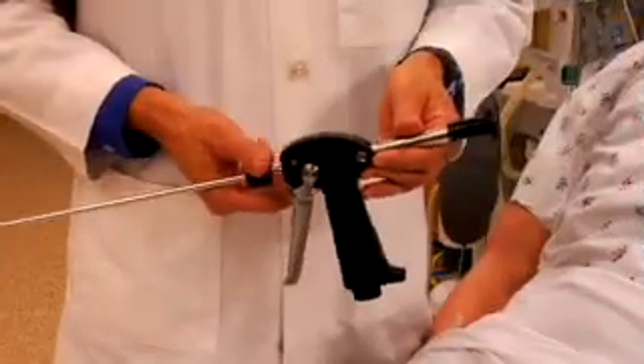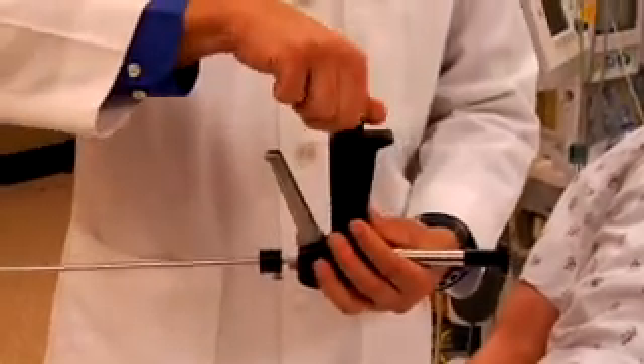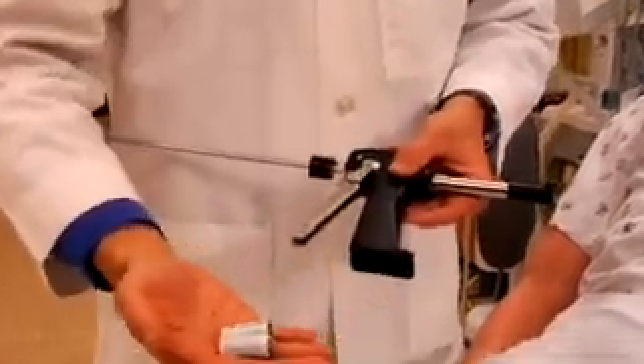To change the batteries of the airway rifle, simply invert the scope, remove the on-off switch, and remove the batteries.